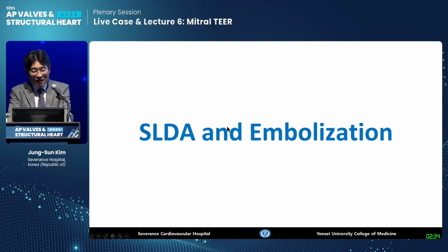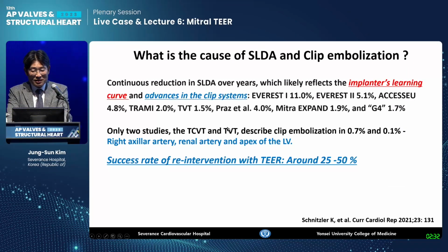So the last thing is SLDA and embolization. I think SLDA significantly decreases over time due to the implanter's learning curve and advances in the clip system.